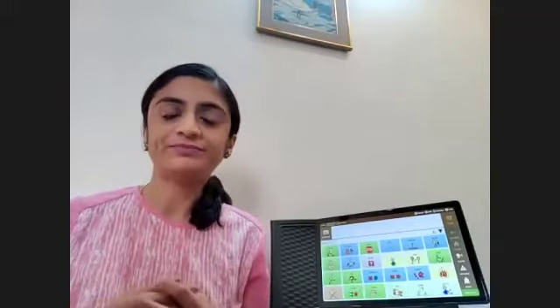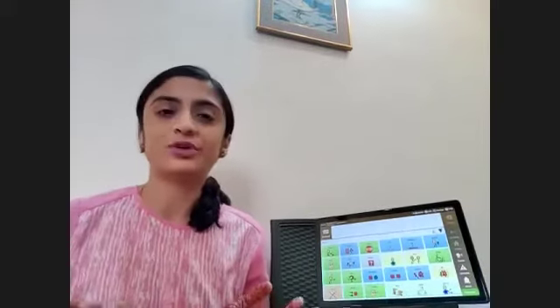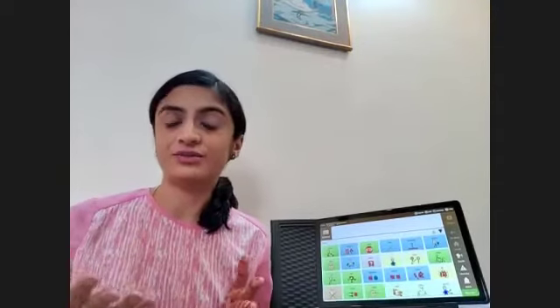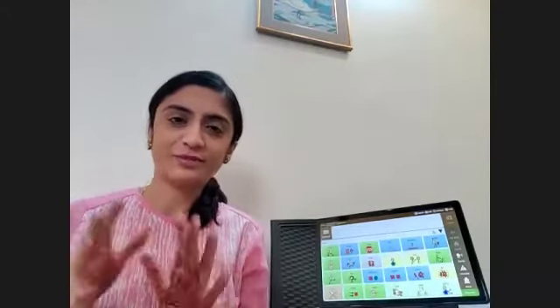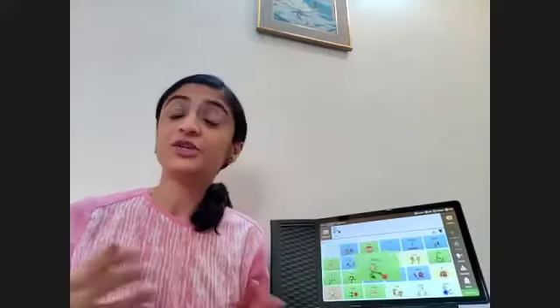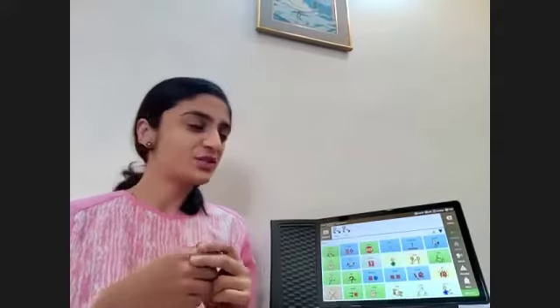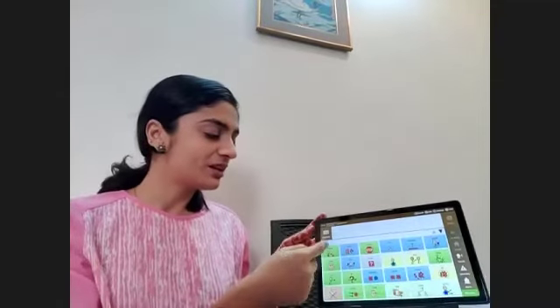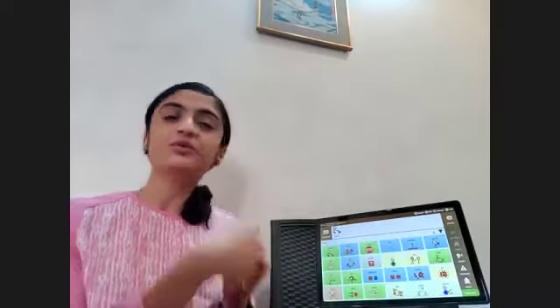So if we ask a question and we want them to respond in a certain way, we can show them how to say it and then ask them to copy it. So I'll give you an example. Suppose you wanted to ask your Avaz user if they want to read the storybook today, right? That's a good question to start off with before this activity. So you say, what do you want to do? And you want them to say, I want to read a storybook. So then what you will do is you will take the Avaz device to them, and then you can say, I want to read the storybook. So now you've showed them what to say.